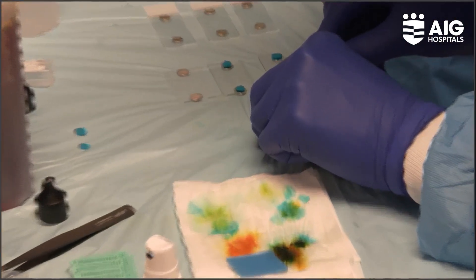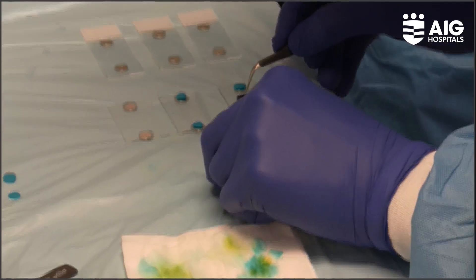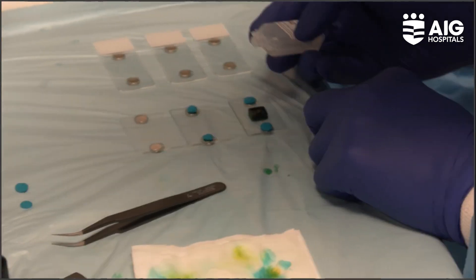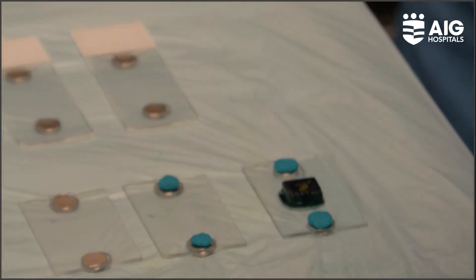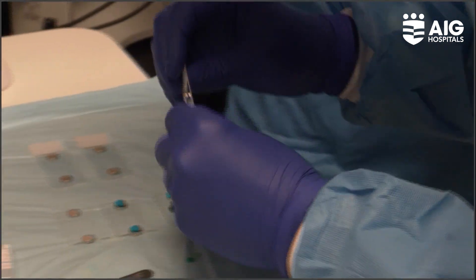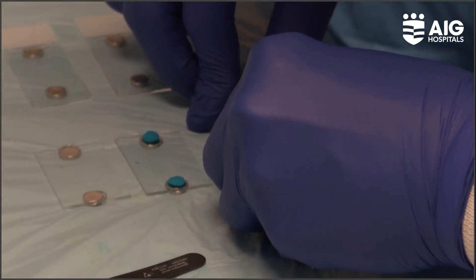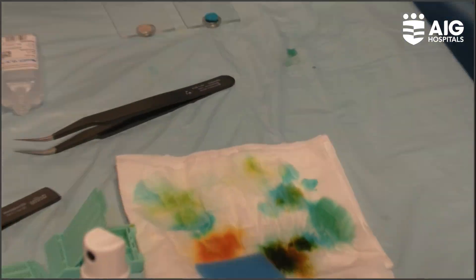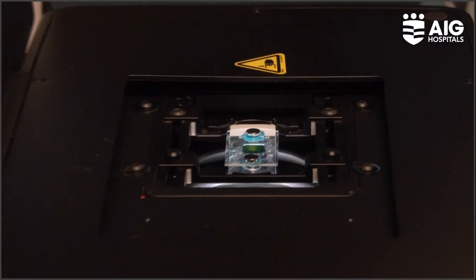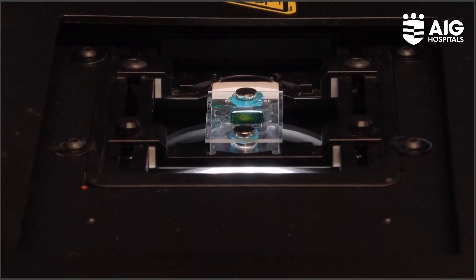The advantage would be it is almost like a tissue instead of cytosmears. Now he is placing the matrix onto the slide, adding a media so that it will be ready to scan the images. This will be loaded onto the machine. I mount the sample with the joystick, navigate it to the center, and take a picture with the macro camera.